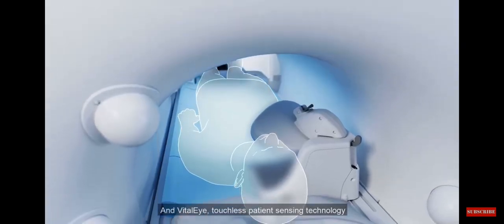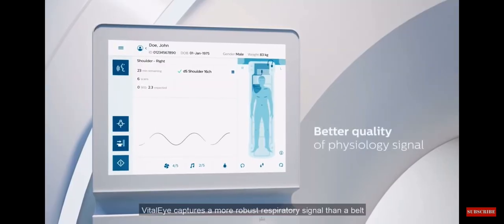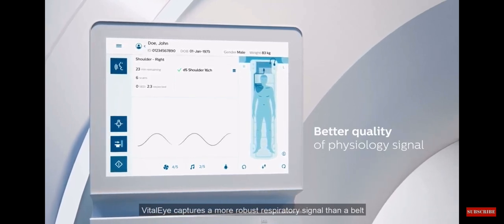VitalEye touchless patient sensing technology removes the hassle of manual respiratory belt placement. VitalEye captures a more robust respiratory signal than a belt, providing superior image quality.